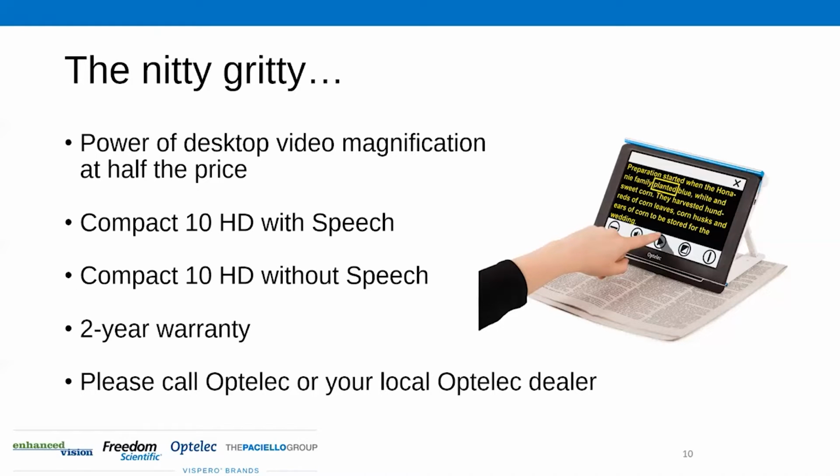I think I'll add to that. Some people might ask, why have two models? Anyone in this industry will know this type of technology is not cheap. It's not cheap to manufacture, and it's certainly not cheap to purchase. We were sensitive to that, because we're trying to remove barriers here, and port across as much of that desktop performance, the power that you find on a desktop, into a portable package like this. And of course, a big part of that effort is to subsequently reduce the cost and make it more accessible for people financially, as well.